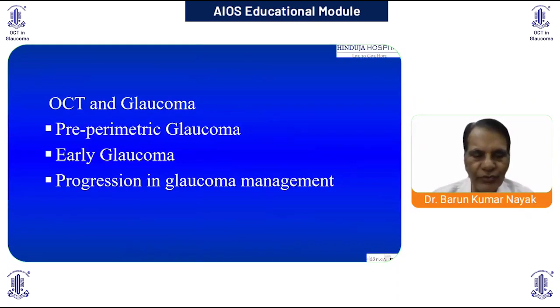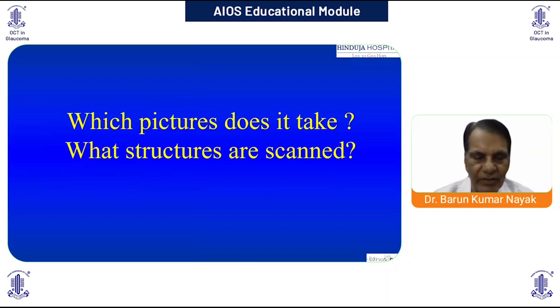It can be used for diagnosis in pre-perimetric glaucoma and early glaucoma, as well as to assess progression during glaucoma management. For proper utilization of the device, understanding of two concepts should be very clear.